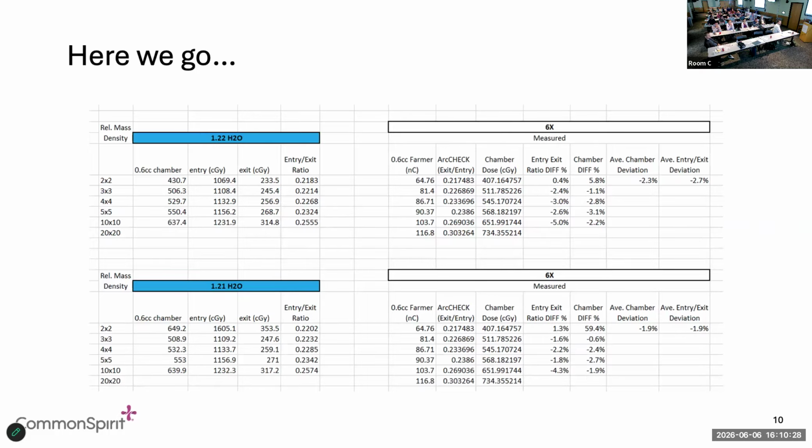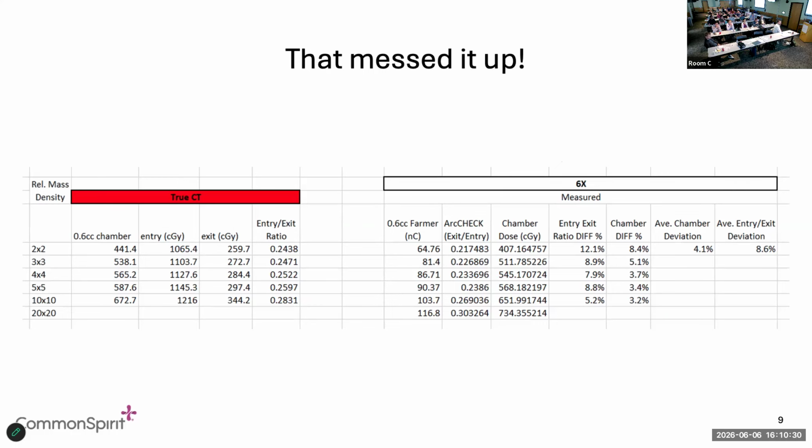Let me circle back for just a second. What I have seen is I'll go to a site, check a prostate case on 3 and 2, something like that, with a 10% threshold, and I'll see like a 97% pass rate on the prostate with the seminal vesicles. And then maybe we do a lymph node, and then it'll be like a 95% pass rate. And then it would say, okay, maybe that's a one-off, maybe it's because the plan is highly modulated or something like that.